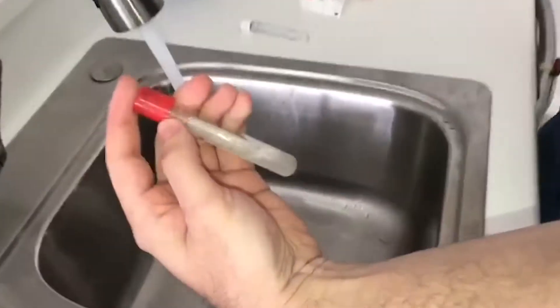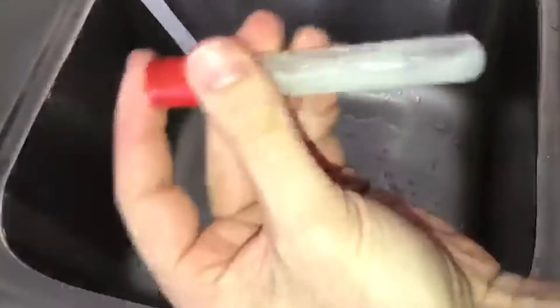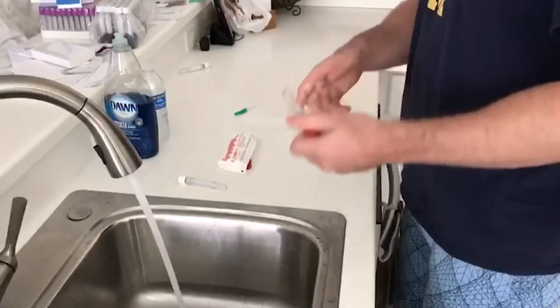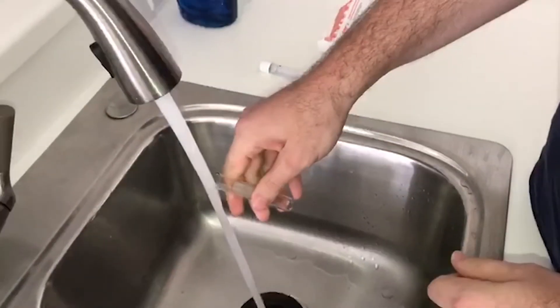Vigorously shake it and figure out if there's anything coming off the wall. Take a look at that — you can really see there's obviously stuff coming off the wall, and that's going into your patient. You can grab the other two from the same batch if you want.